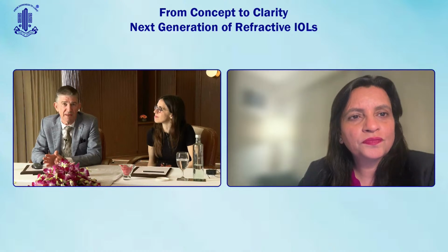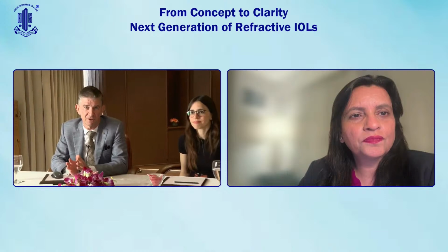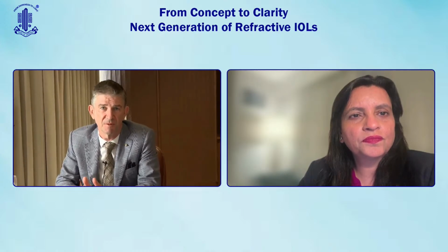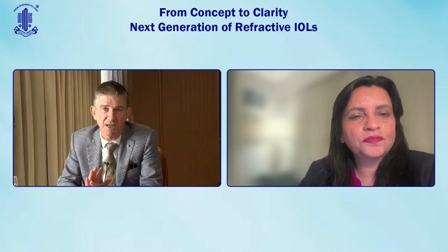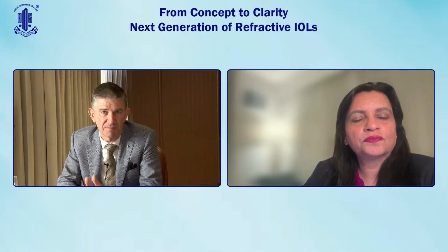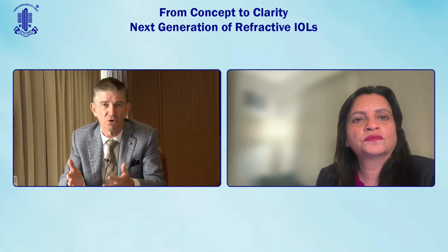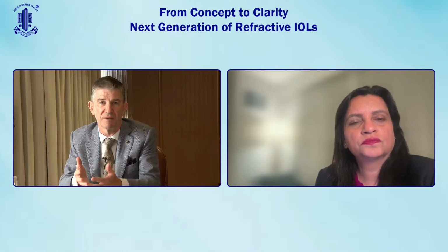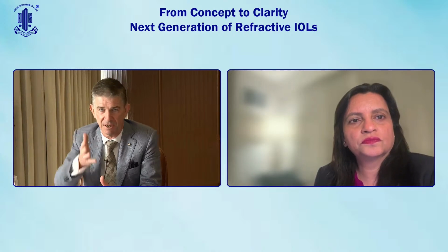I'd like to preface my answer by saying that when you're starting out for the first time, start with patients who have no comorbidities. When you're putting your first 10 or 20 lenses in, start with patients who have very healthy eyes so that you can get a very clear picture in your own mind of how well this lens is performing. And once you've got the confidence in normal, healthy eyes, then you can proceed to using it in cases like I've presented.